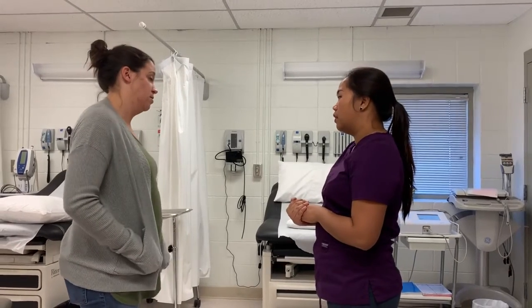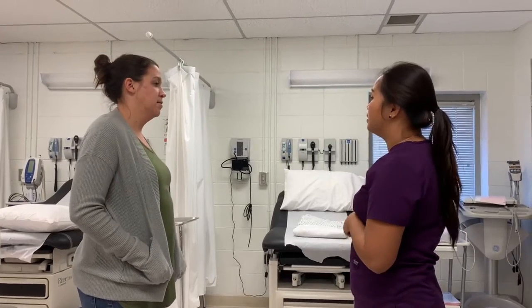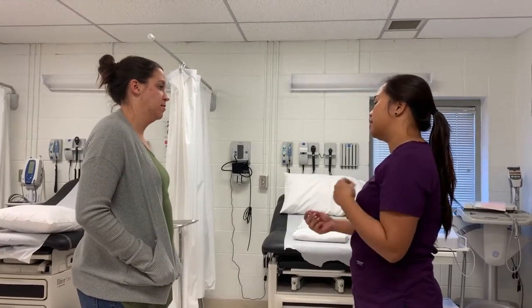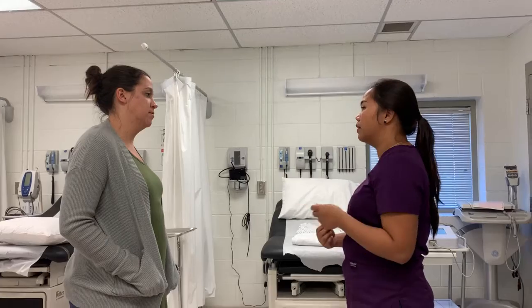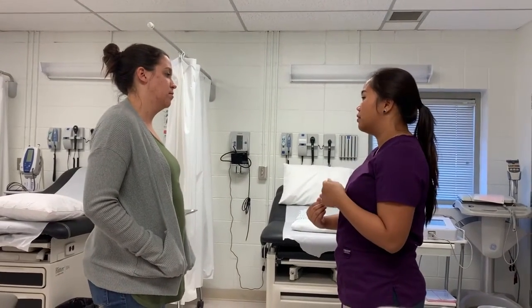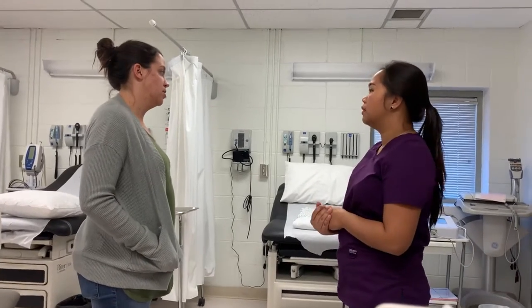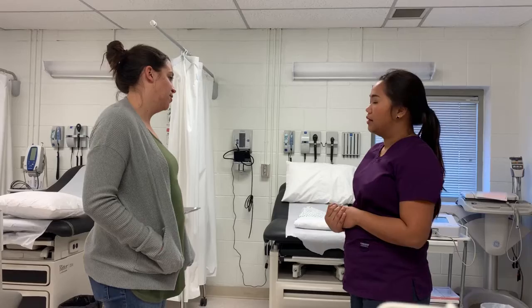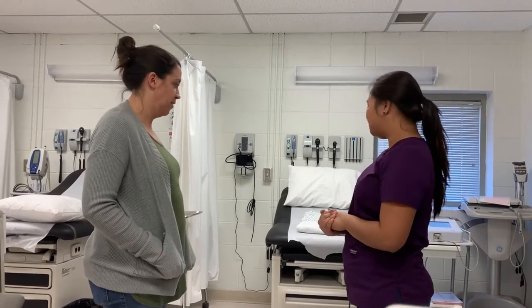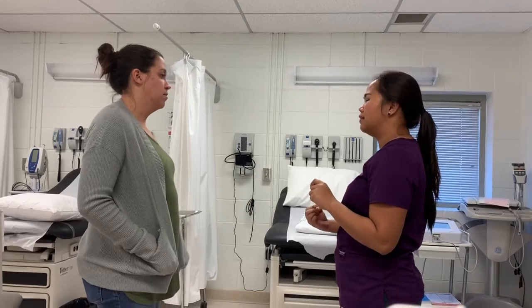Have you had an ECG test done before? I have not. Okay, so what I'm going to do is use this instrument, the ECG machine. I'm going to put the little stickies on you, and it's going to take the recording of your heart's electricity that's already in you. Okay. Do you have any questions for me? Is it going to shock me? No, it is harmless. Okay. It's just a little bit cold.